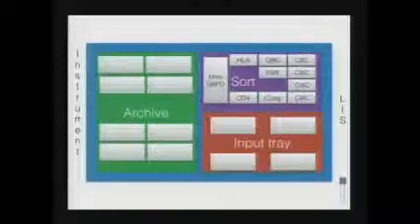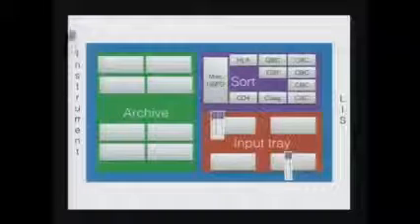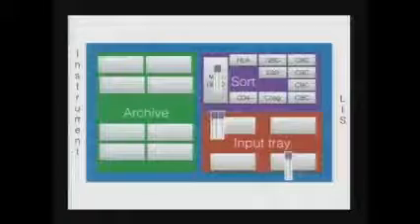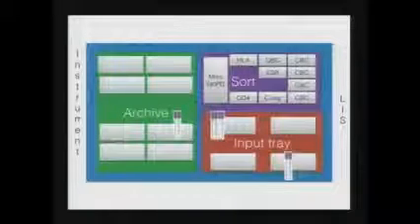So what this did to us is the person swipes or checks the barcode. He first gets it from the input tray because all the samples first get into the input tray, and then the sample is sent through the LIS, meaning we just manually swipe it into the LIS and then it goes into the sort tray. And from the sort tray, it goes into the instrument. The person who's doing the test on the instrument carries the samples to the instrument, finishes the test, and comes back into the input tray. And if the sample has another test, it would go into the next test of a G6PD. And then if everything is done, it goes into the archive.